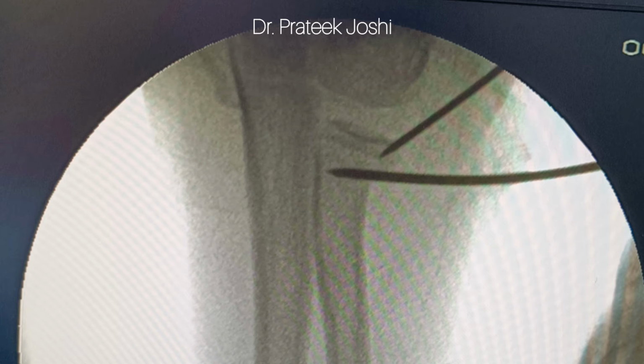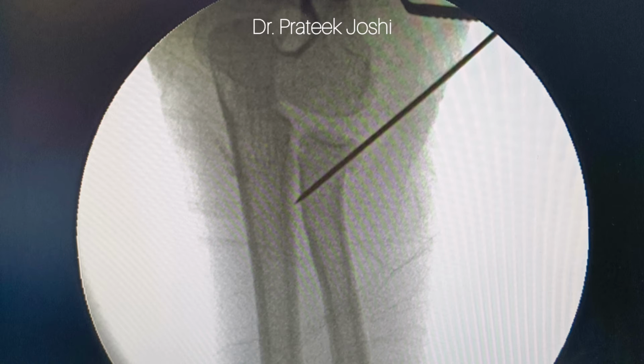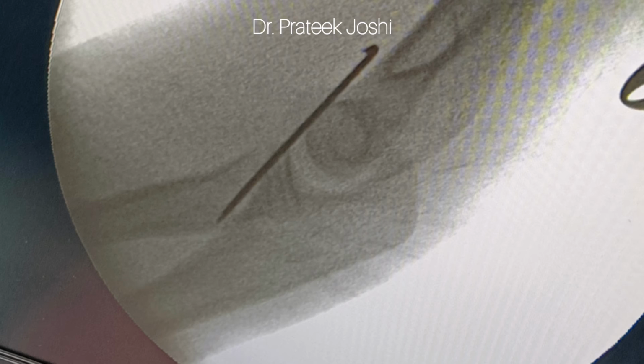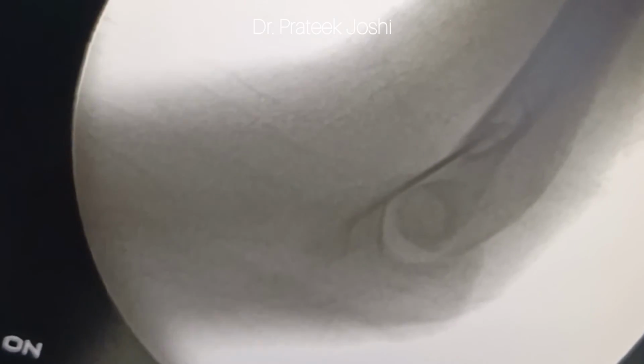Once it is held reduced, I am going to drill a K-wire through the radial head, and I am going to drill it gradually to engage the opposite cortex, which is going to stabilize this fracture. This K-wire is going to reduce any chances of loss of reduction in future, which was a possibility with only plaster. We can put another K-wire if need arises, but in this case this is sufficient, and you can see the stability throughout the range of motion is quite good.